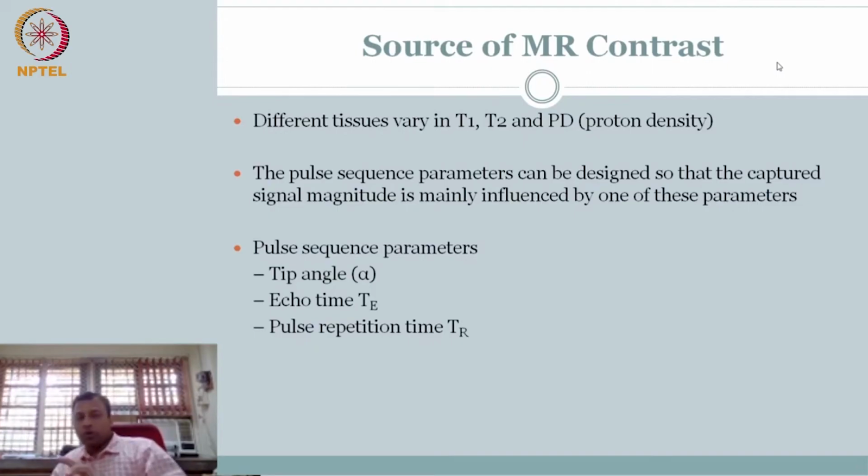Right. So now we are going to use these two concepts and take a simple example case and see how the difference in black, white, gray, which we perceive as contrast, relates to the tissue type and our pulse sequence parameters. That is what we are going to cover. Of course, in the next module, data acquisition and reconstruction, we will go about doing this. Now we are understanding where the contrast mechanism is coming from, and how these parameters control the contrast that arises in MR. How we actually execute it will be in the instrumentation and reconstruction.